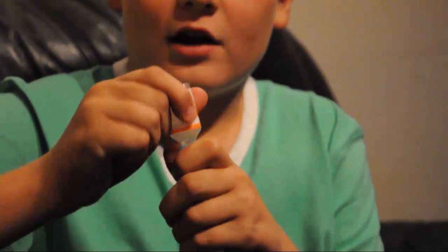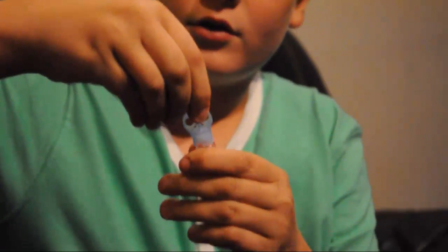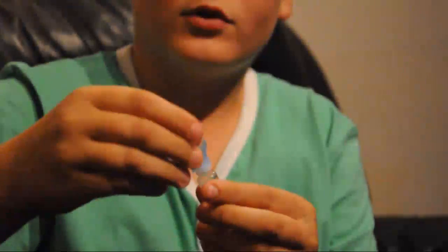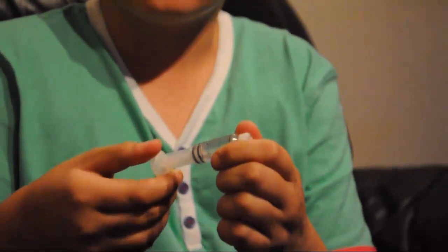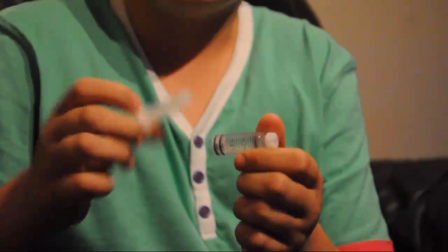Then you just take the vial off the top, like that, twist this bit, and pull. When it's like that, don't just pull straight off, otherwise you'll break the reservoir. And then you just twist this anti-clockwise, gently, so it comes off like that. So the little pushing bit's off.